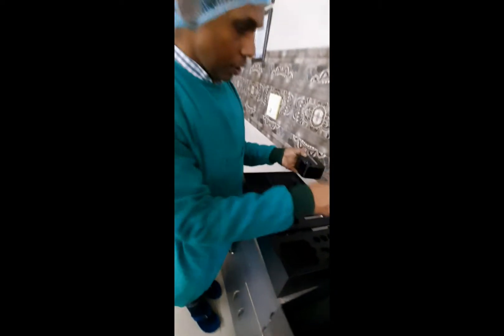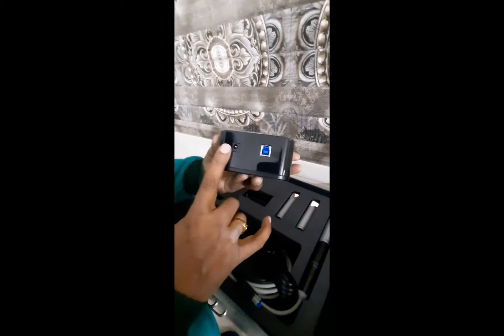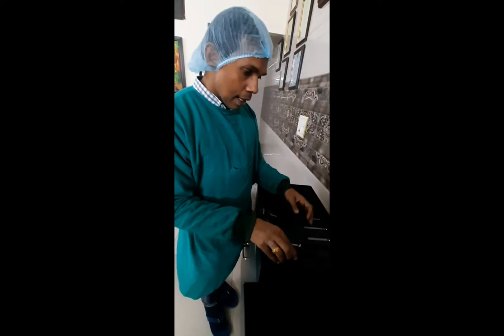Then we have the data hub, which is very important. You're going to place the handpiece here and these are the connections. You're going to connect to the laptop and to the handpiece.